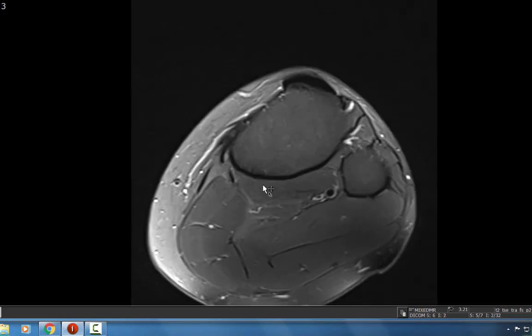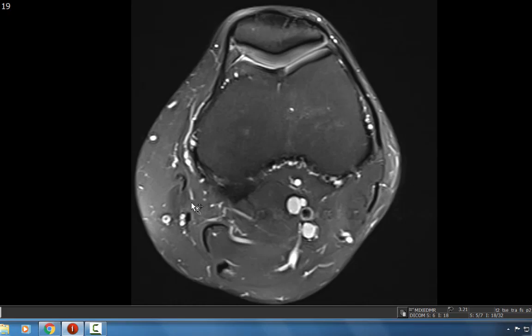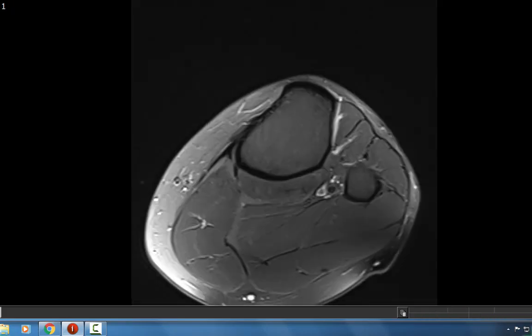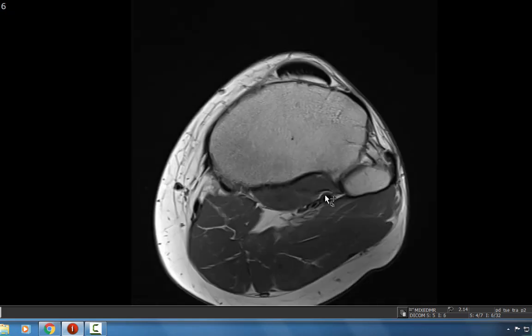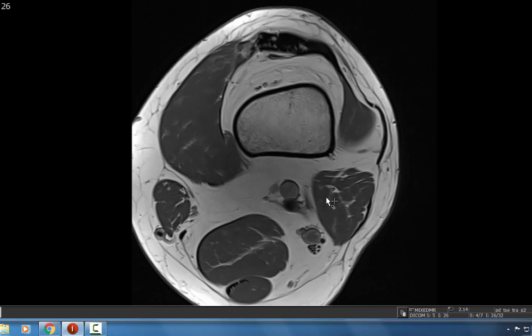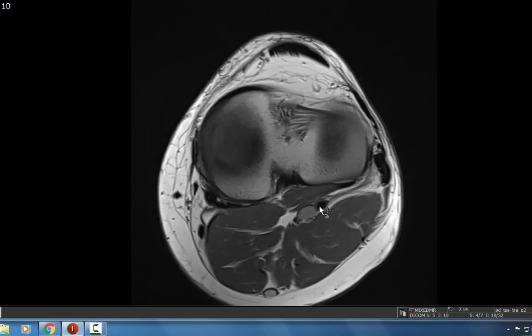We also look at the subcutaneous tissues to make sure there's no edema, focal fluid collections, or masses. On the proton density we corroborate those findings — there's no atrophy within the muscles and no T1 hyper-intensity to suggest fatty atrophy. That's essentially how I evaluate a knee — my search pattern covers the osseous structures, the cartilage, the joint, the cruciate ligaments, the menisci, the extensor mechanism, and the muscles and bursae. Hopefully that gives you an introduction to evaluating MRI images of the knee. Thank you so much for your time and attention.